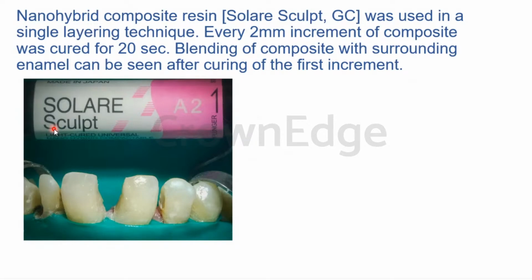That is why when we air dry, we evaporate that solvent into air, right? So when you gently air dry the bonding agent, you are helping the bonding agent get deeper into the tubules. You're also helping it to get evenly distributed, hence avoiding pooling, as Shishan said. And also, we are removing that solvent, which is not necessary for our hybrid layer, right? So I hope those 3 points are something that you take back from today.